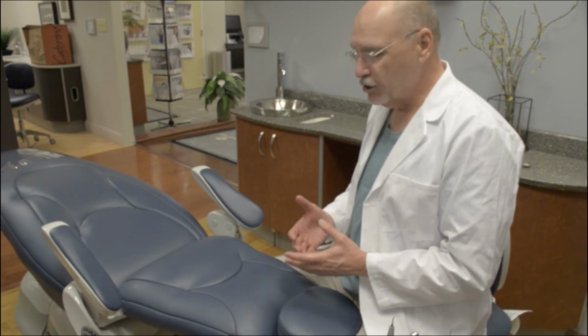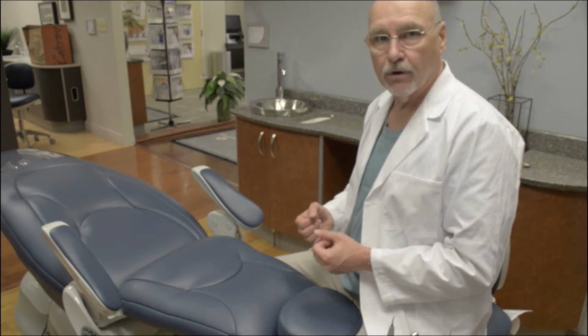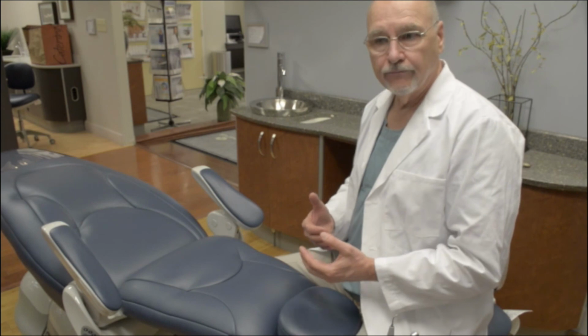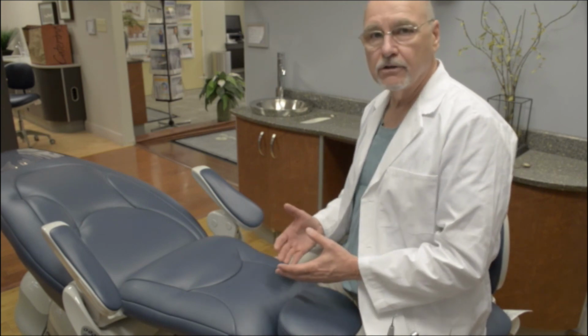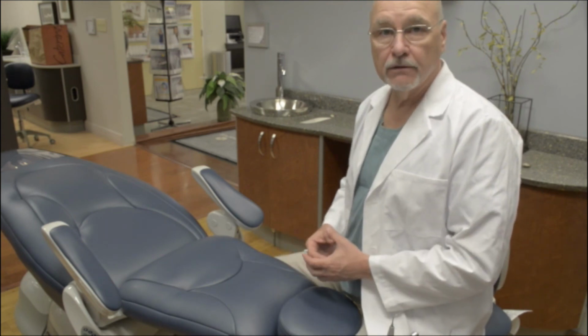And the way we're going to achieve that is the appropriate positioning of you, and then the patient, and then the assistant relative to the patient, to create an ergonomic environment to deliver care that allows you to practice a lifetime.